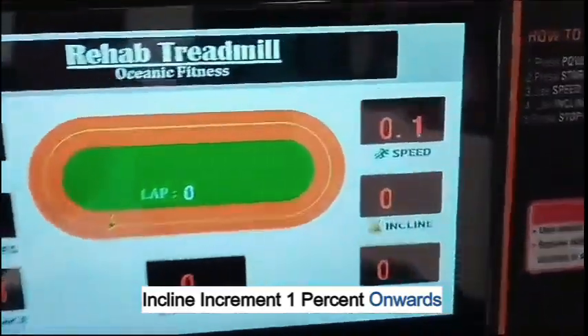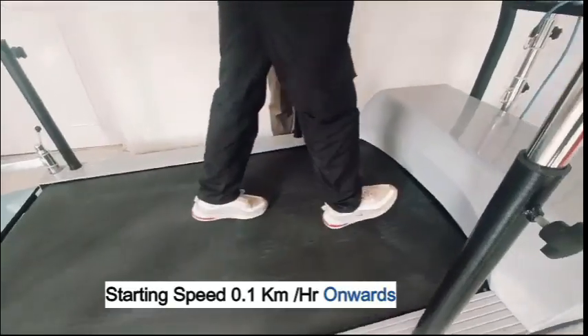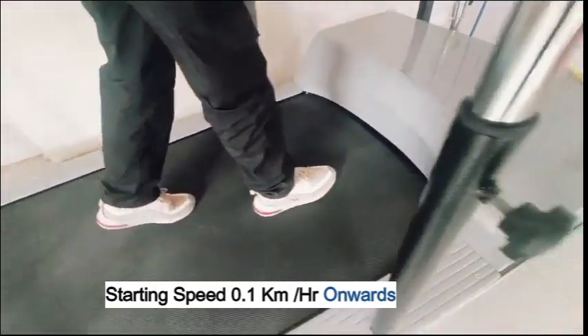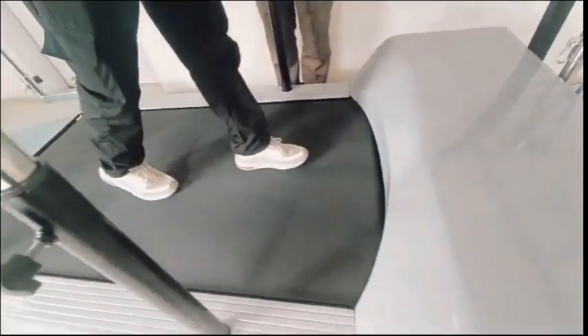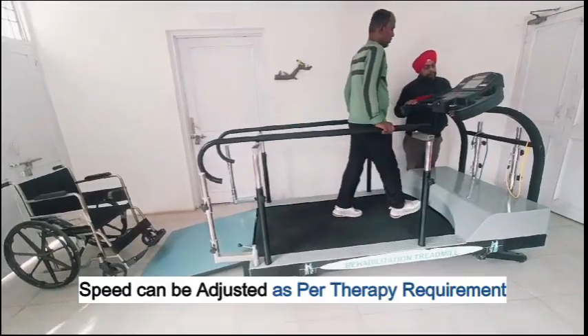Incline increment starts at 1% onwards. Starting speed begins at 0.1 km per hour and can be adjusted as per therapy requirement.